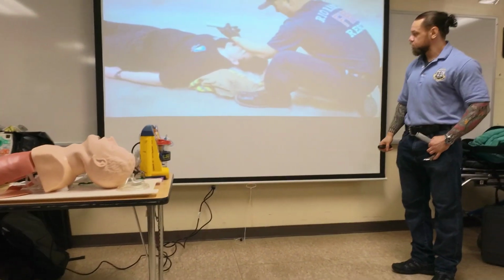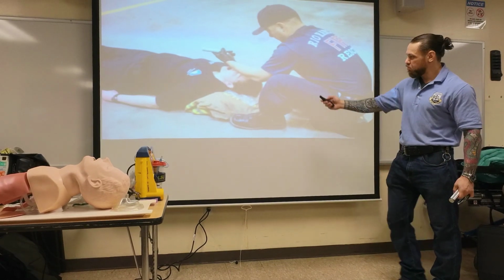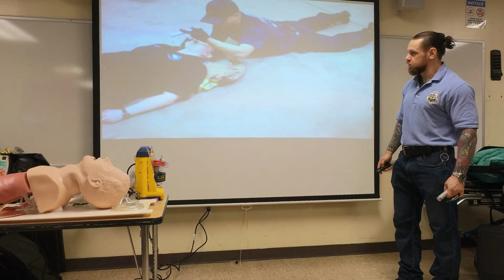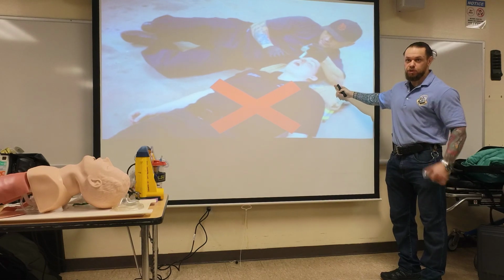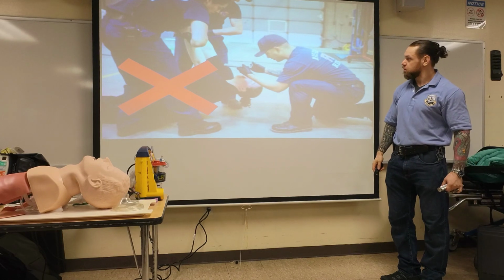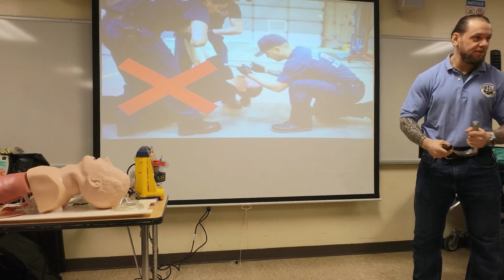So, some of the positions. You see here the paramedic is trying to intubate. I would say the position is not great, but sometimes you have to do this. This is in the lying down position. And then don't do this. Why? Because you have no leverage. You can't lift. What is wrong with this one? It's all wrong, but I see this all the time in the field.